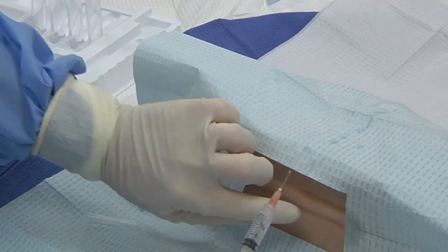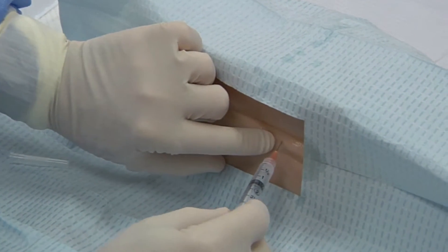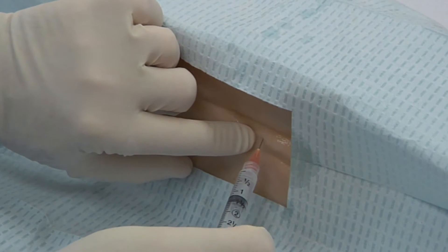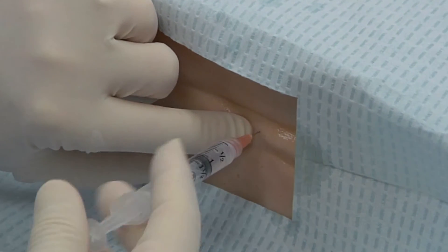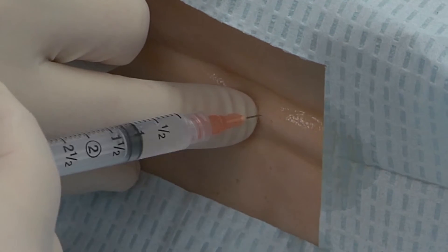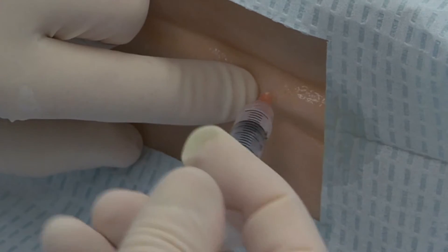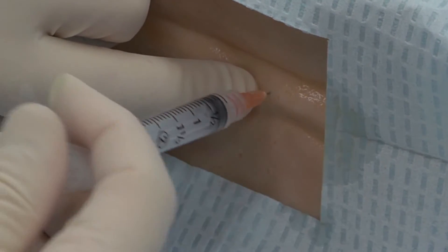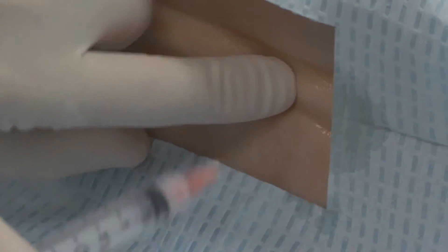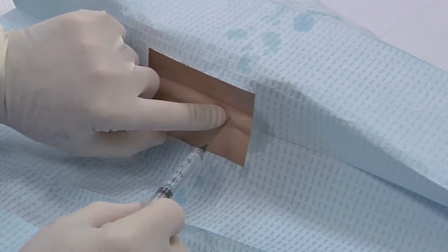First, you will anesthetize the skin, and then you will infiltrate the lower tissues such as the ligaments, muscles, and other subcutaneous tissues. You may wish to use a longer needle to reach these deeper tissues.